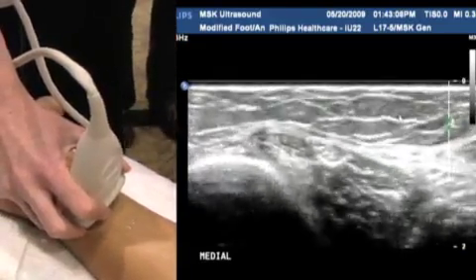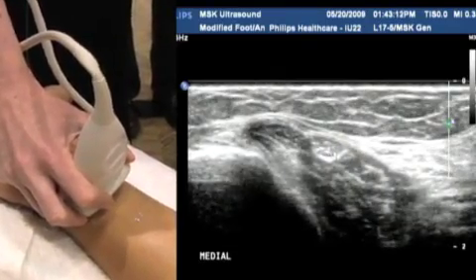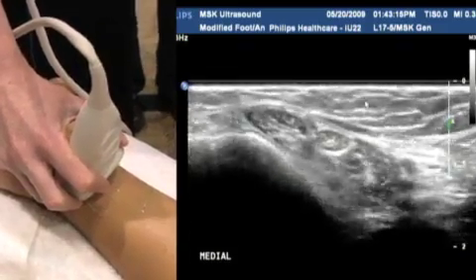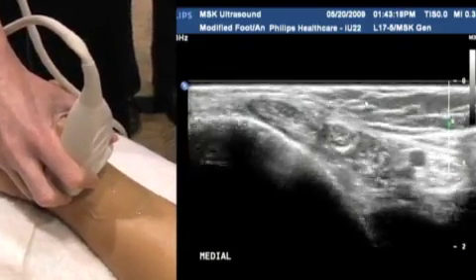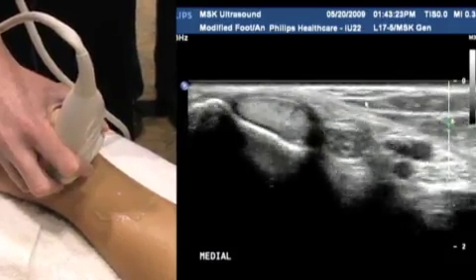So heading back now proximally in the tendon complex. You see here flexor digitorum longus with its muscle at the back. We're going to do exactly the same thing. We're going to start proximally. We're going to follow that tendon distally, heel toeing all the way, making sure it stays nice and echogenic.